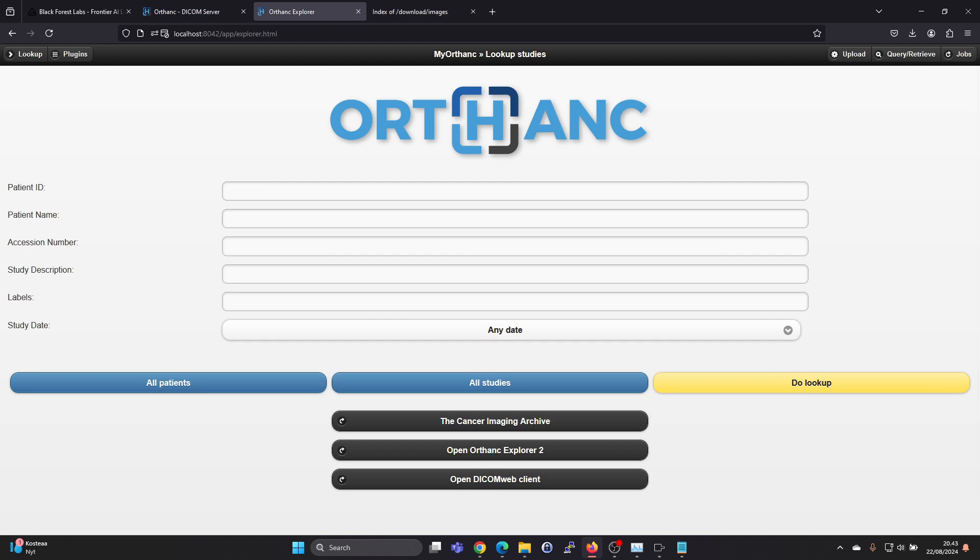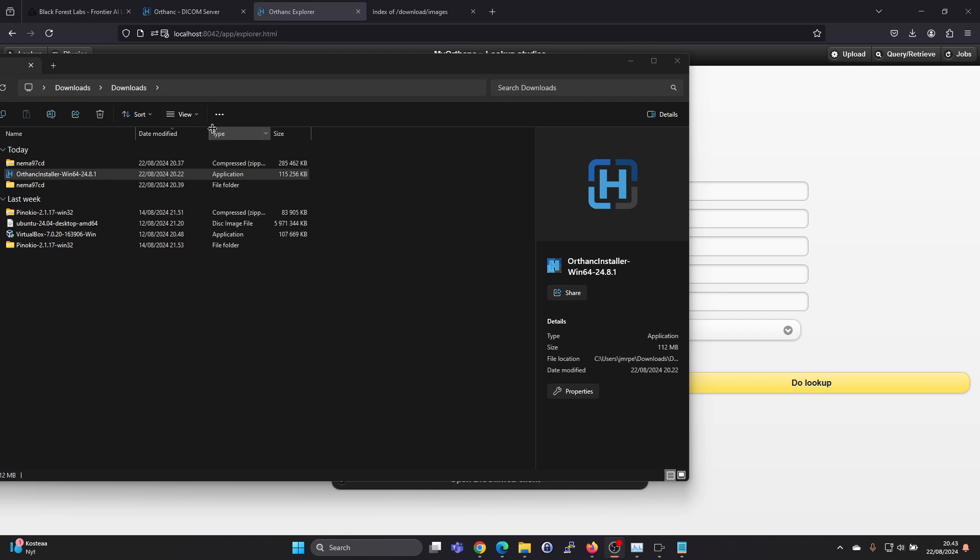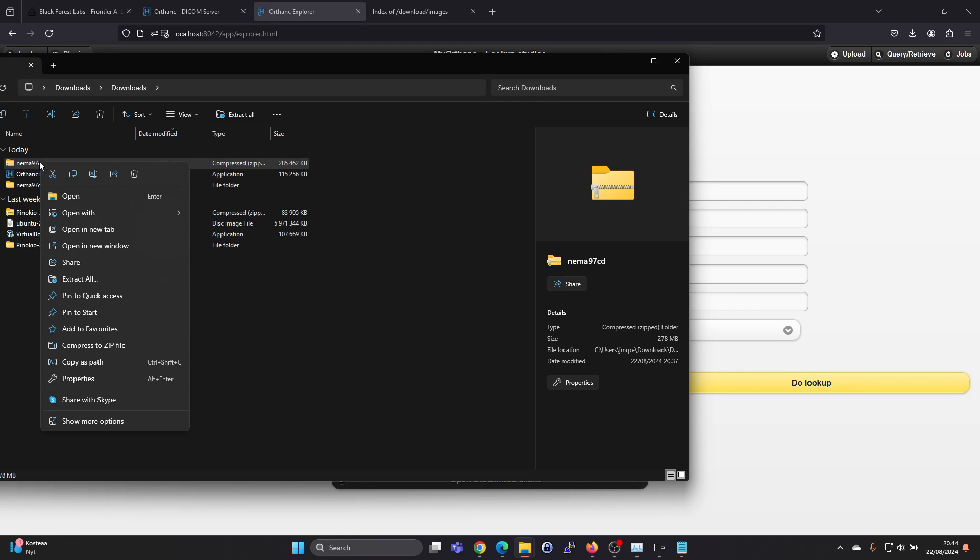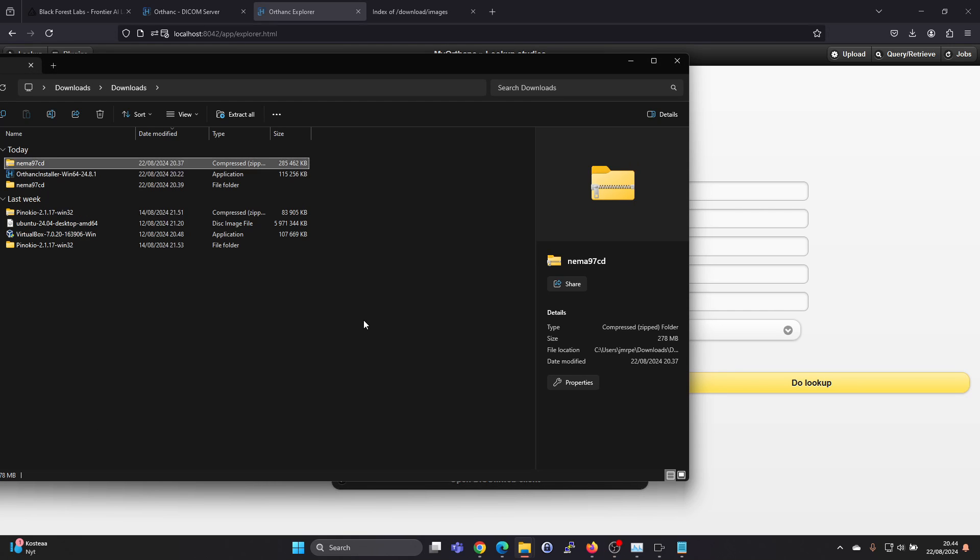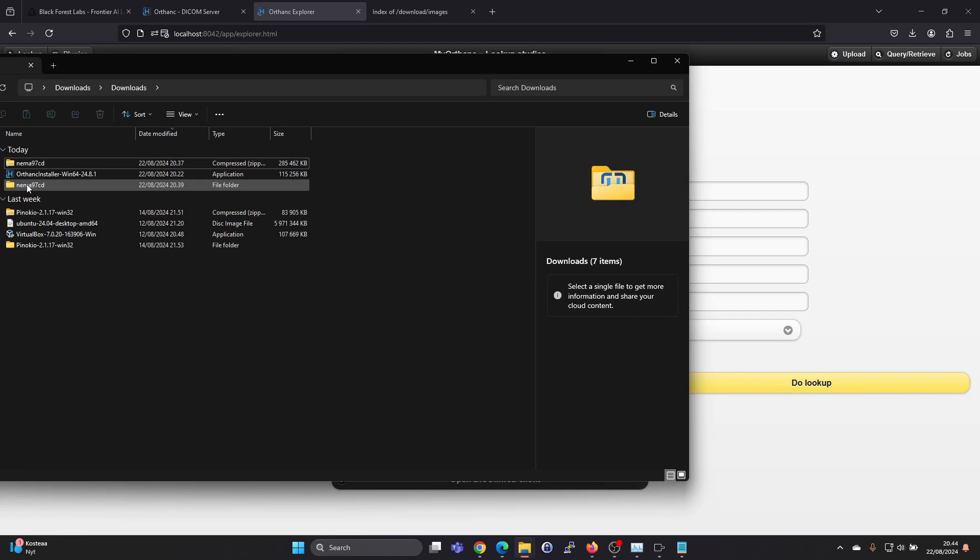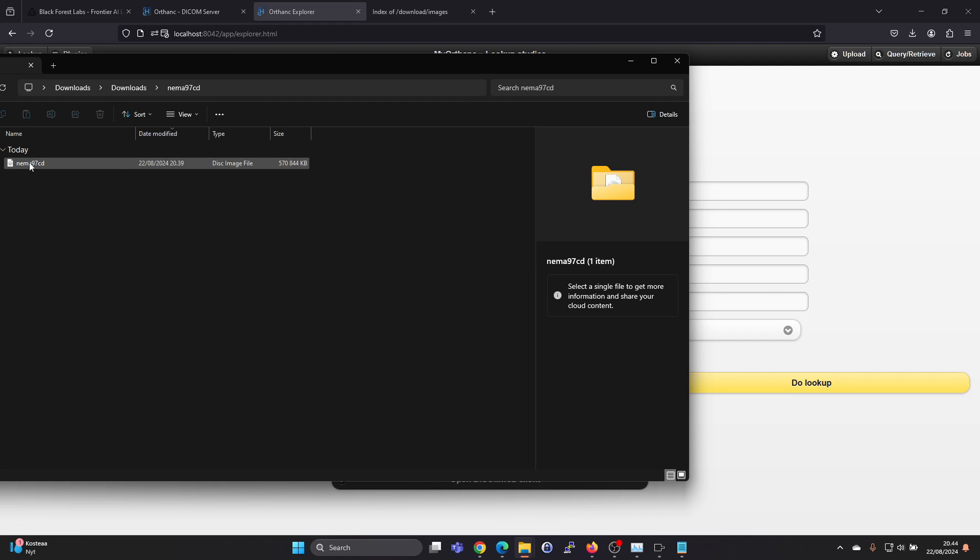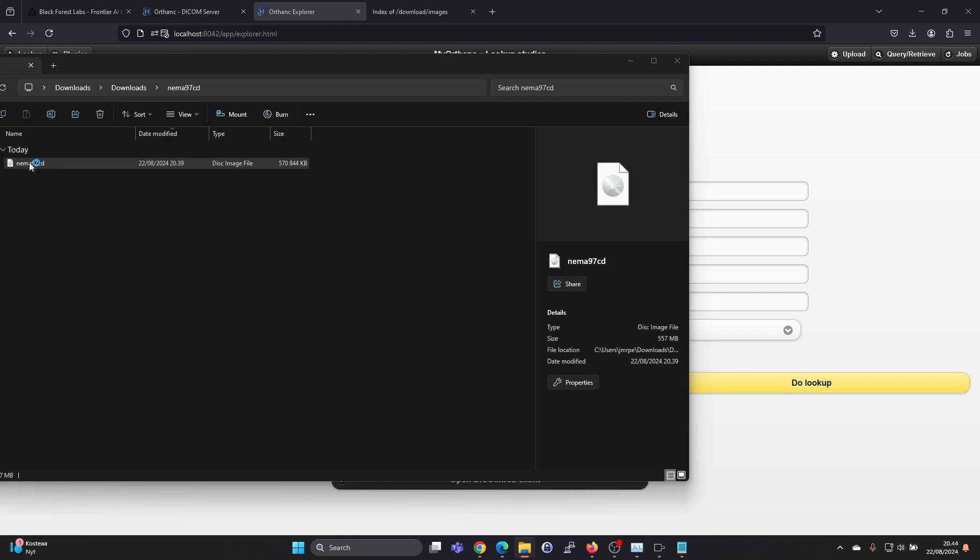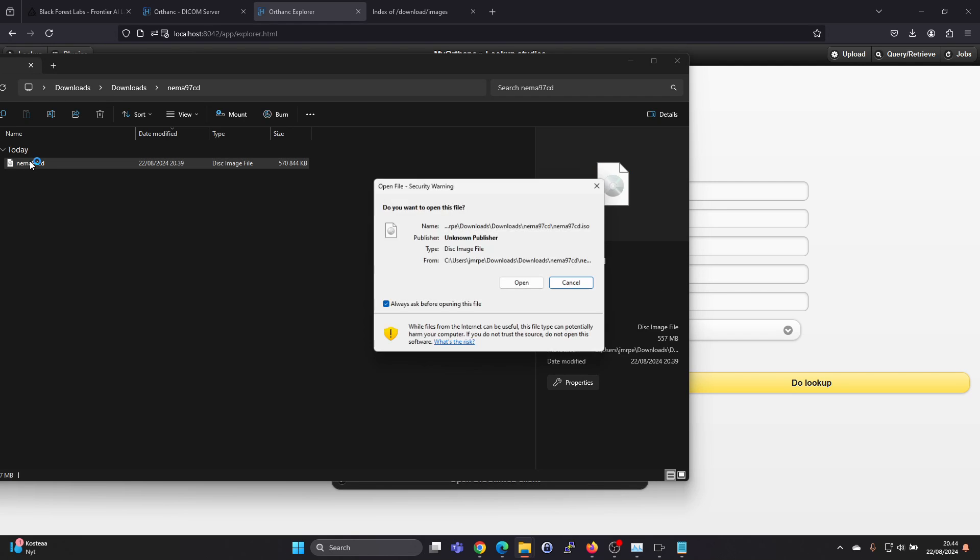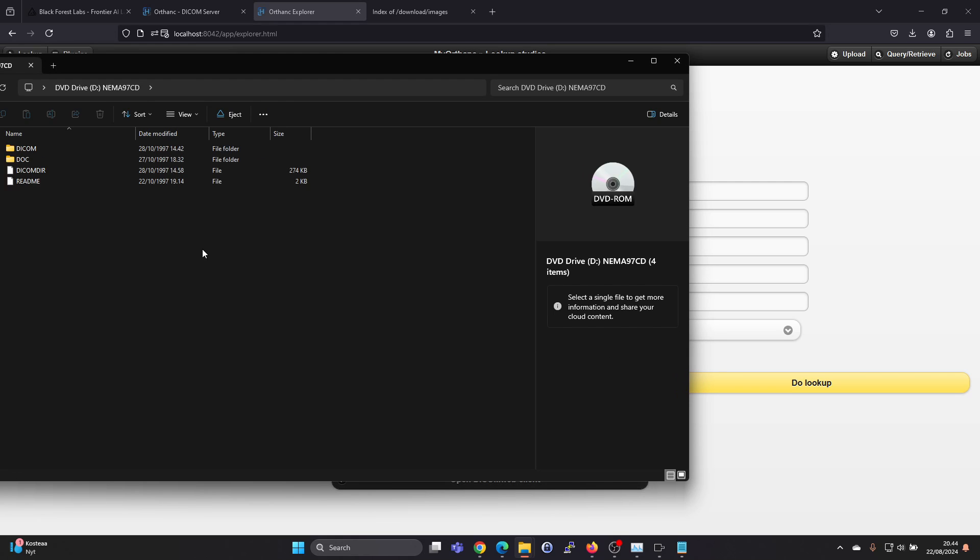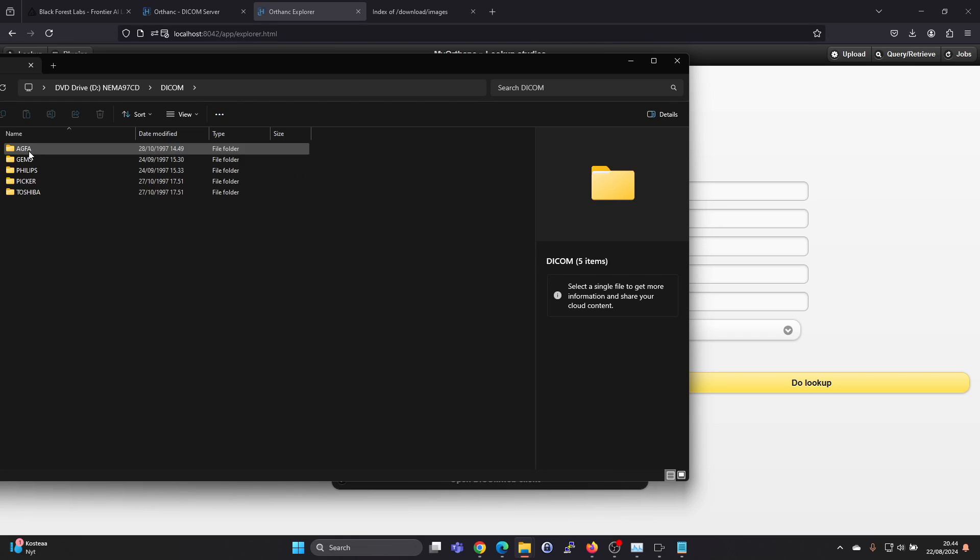After downloading that, you will need to extract it. So you can right click on the download and say extract all. And here we have the extracted package. It's a disk image file. But in Windows 11, at least, you can just double click on this and say open. And you can navigate into here.